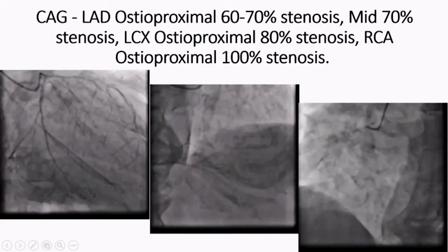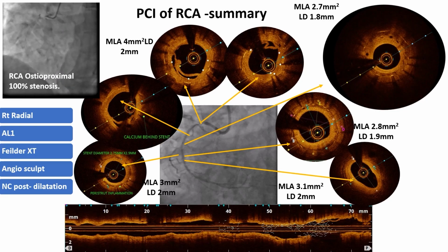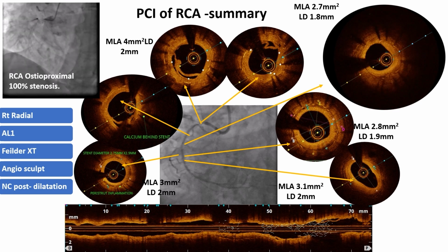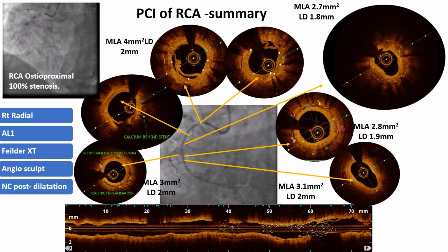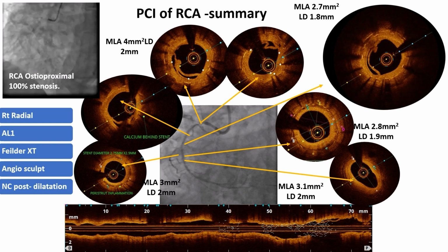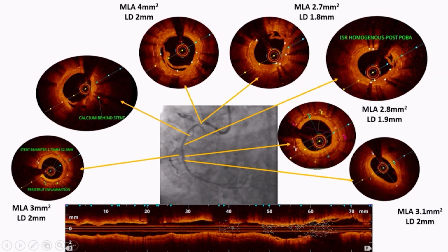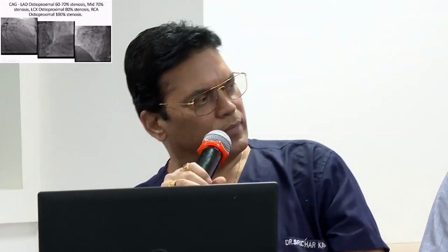Over to Dr. Shailendra Singh. He came with significant angina and his troponin-I was elevated, so we admitted him and did the angiogram. The plan would be to just open the RCA first and then go for LM to LCX stenting. The history is quite classical, the patient has unstable angina. 2018 was his last angioplasty, and now in 2023, five years later, he has come with significant unstable angina and troponin-I elevation. Pierre, you want to discuss anything?